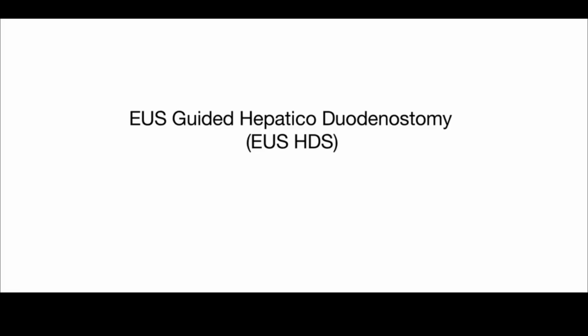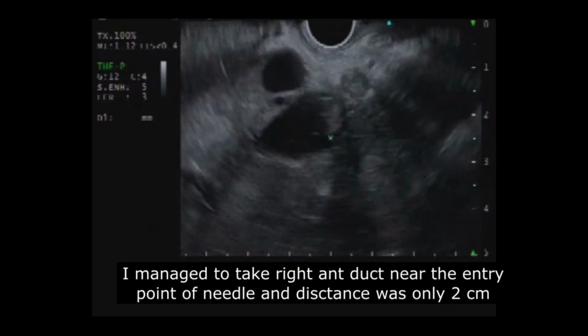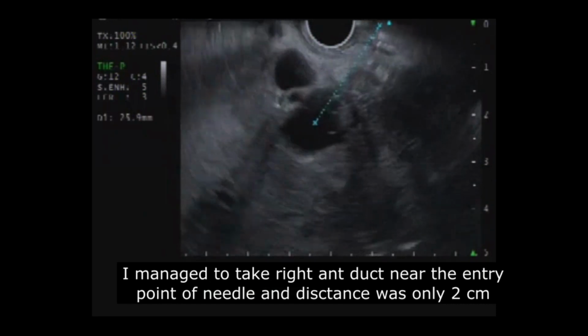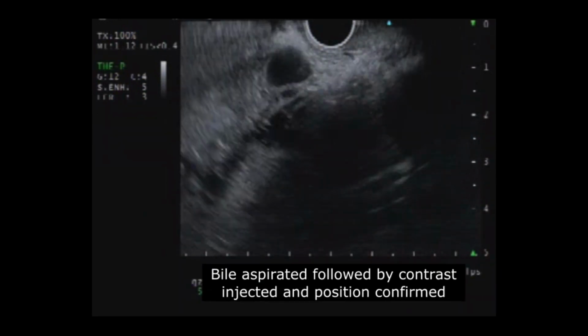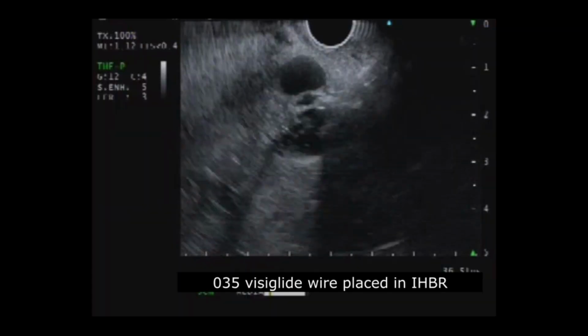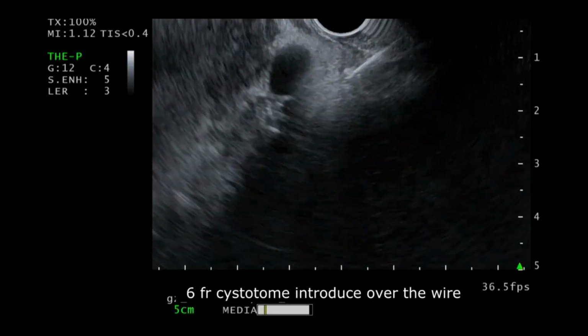We can see the US and ERCP guided wires were both in different ducts, meaning the ERCP wire was not in the right duct. Then finally I decided to do US hepaticoduodenostomy. I managed to target the right anterior duct near the entry point of the needle, and the distance was only 2 cm. Then the duct was punctured with a 19G FNA needle, bile was aspirated and contrast injected, and position confirmed. Then a 0.035 Visiglide wire was placed in the IHBR, then a 6 French cystotome was introduced over the wire.